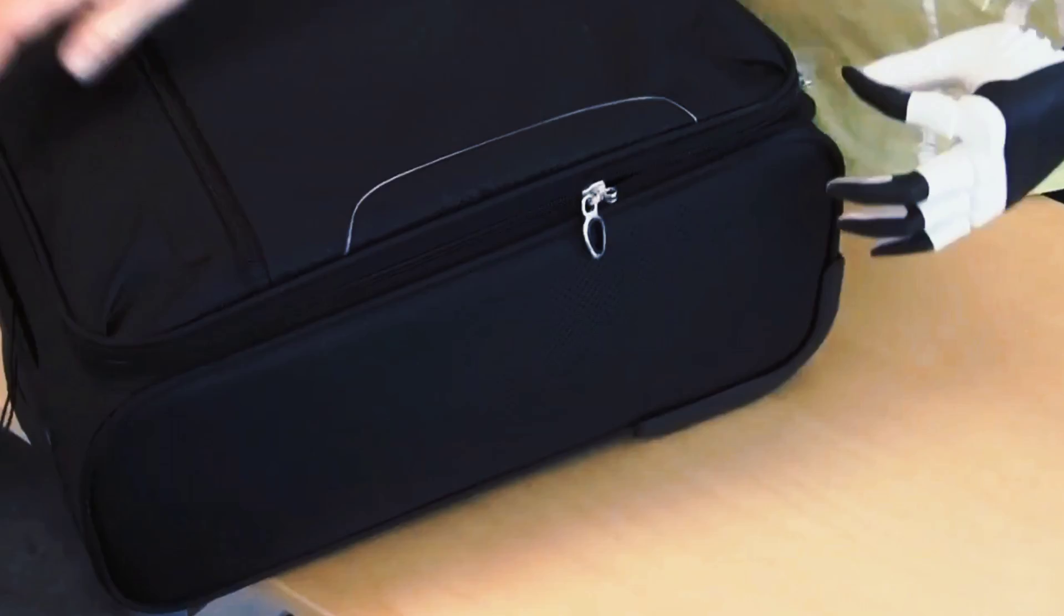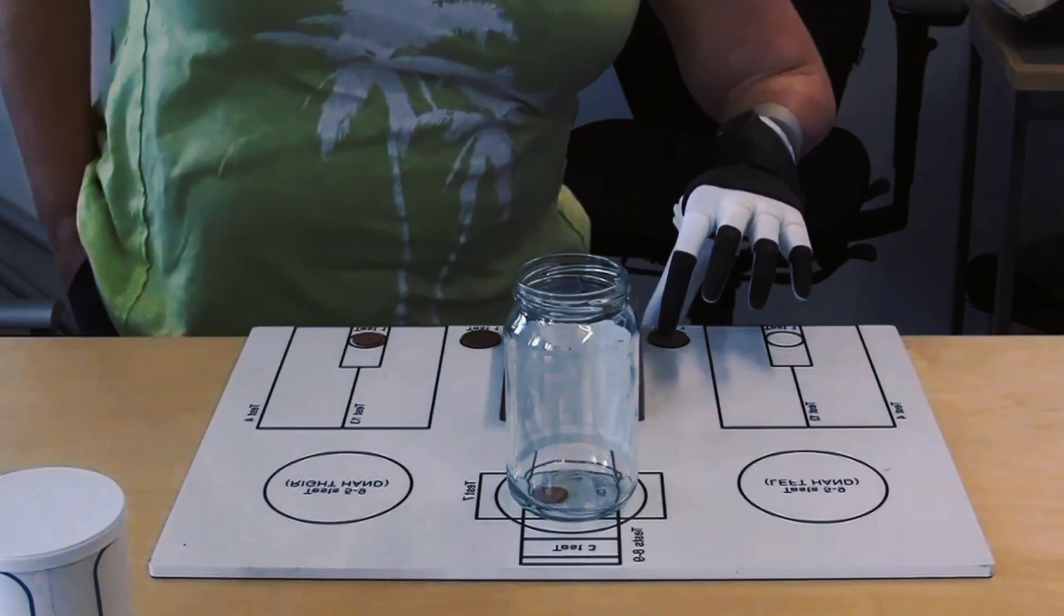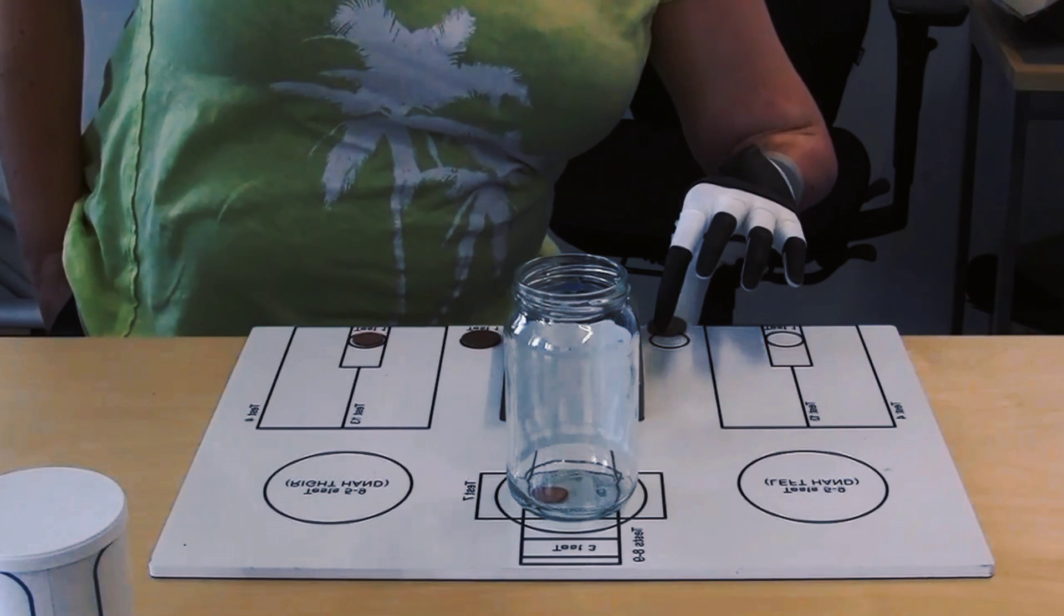It also has six motors that can move the fingers independently, allowing Karen to perform various tasks such as grasping, pinching, and pointing.